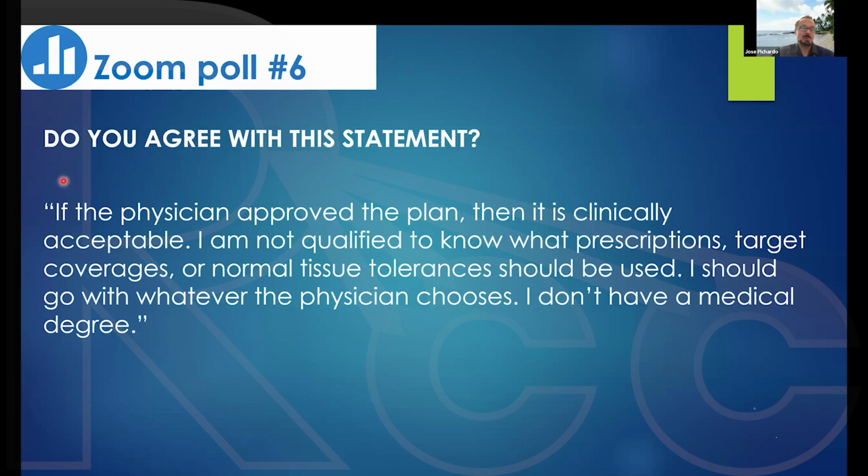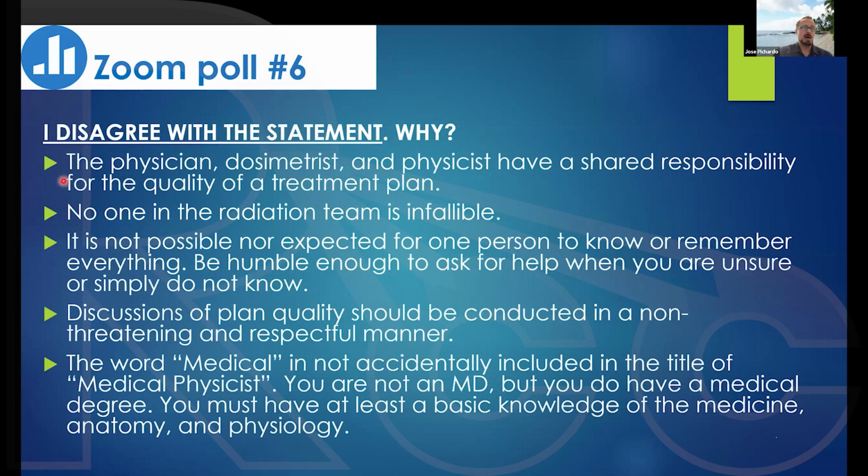Because I'm just going to show you what I think. I mean, like I said, this is more of a personal choice, but I'm going to show you my rationale for my choice. Now, I disagree with that statement. Why do I disagree? Because we all, physicians, dosimetrists, and physicists, have a shared responsibility for the quality of the treatment plan. It's not up to only one person.